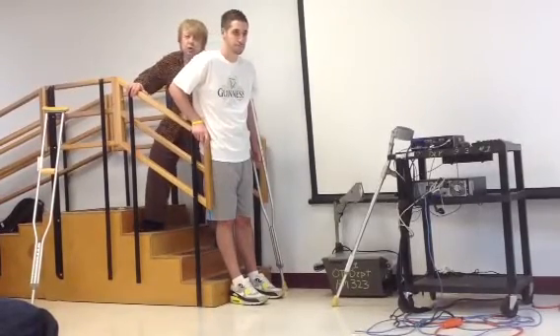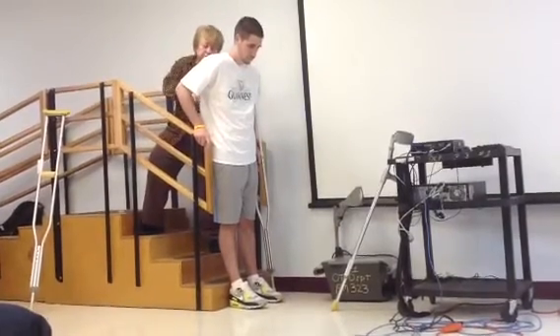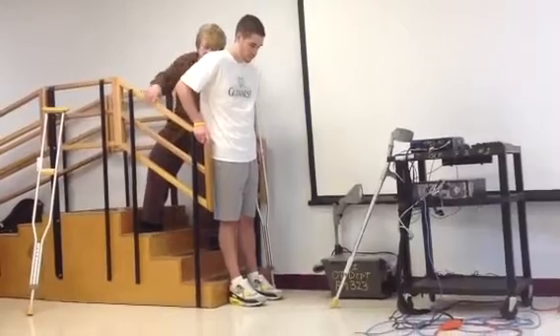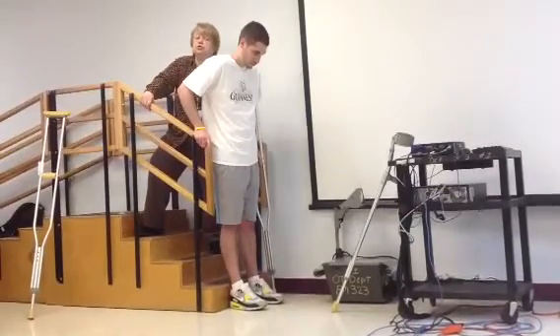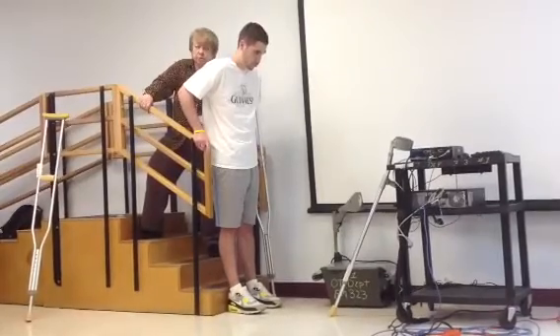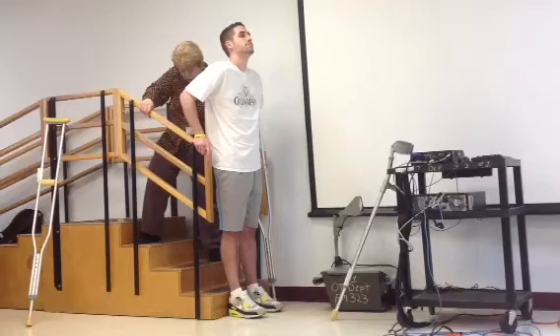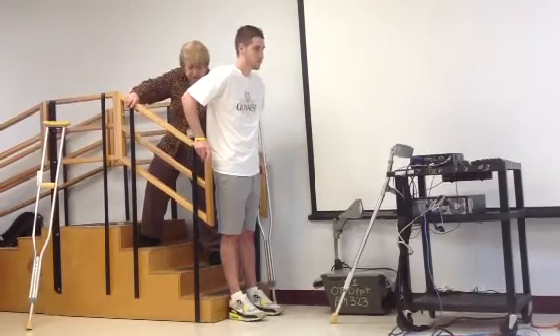Now you're going to push up on the crutch and your hand, and you're going to look up as you're pushing up. Then look down and bring your legs up onto the step.